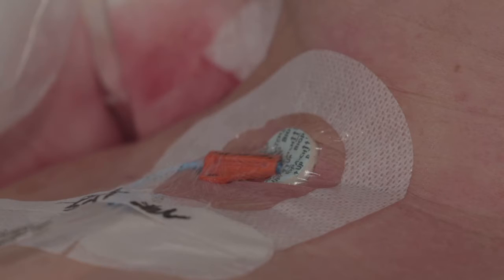Do not turn or twist the SecuraCath from its original position. Be sure to cover the insertion site, the SecuraCath, and any external portion of the catheter up to the extension tubes with the transparent dressing. This will prevent pulling or kinking of the catheter.